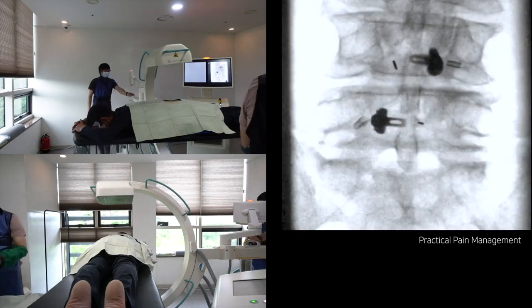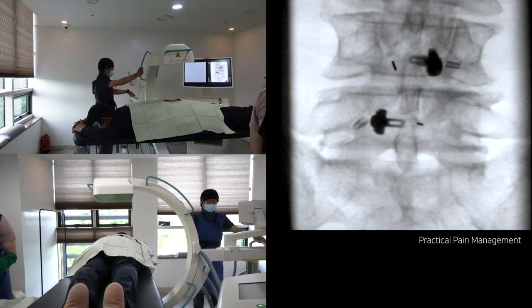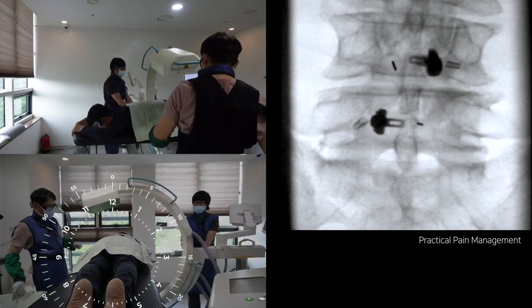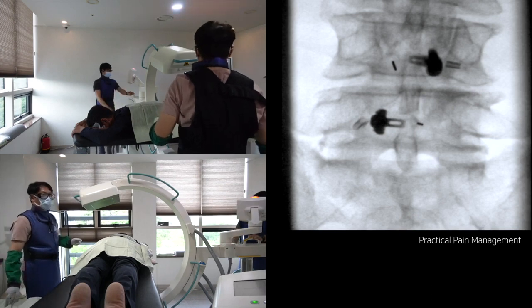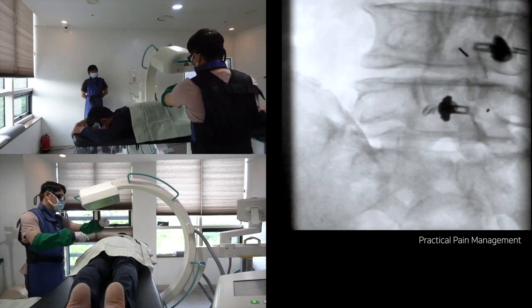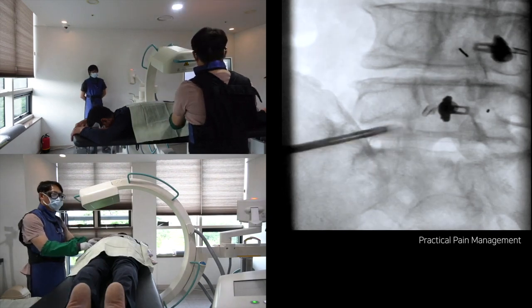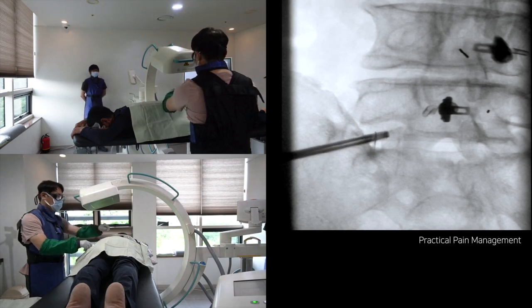The C-arm is in a position of AP and 5 degrees of cranial tilting. He is operating the C-arm to the ipsilateral oblique view. The compass shows 20 degrees of left rotation. Let me begin. It will sting. I will put the needle in the ordinary puncture site.